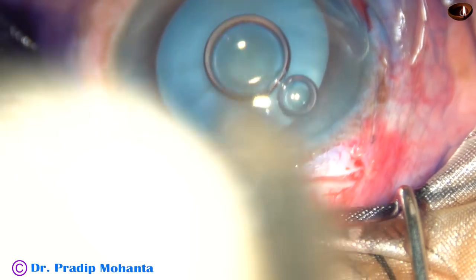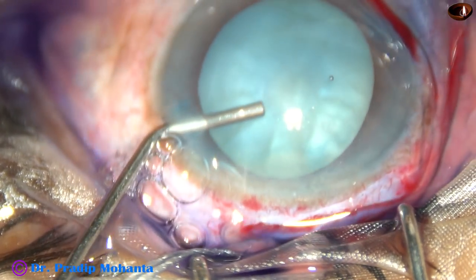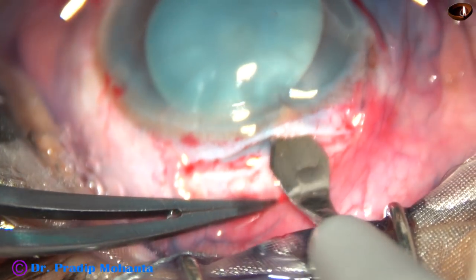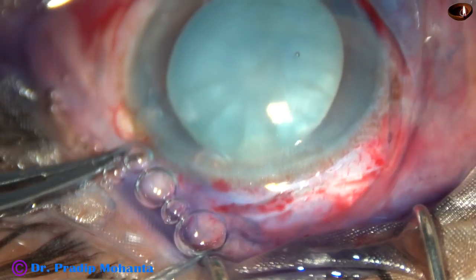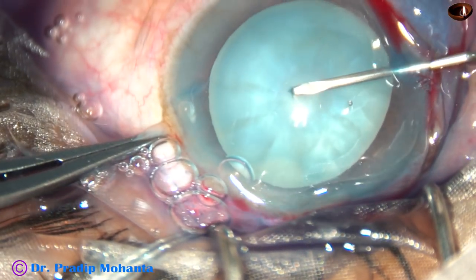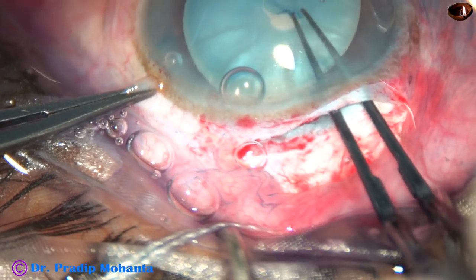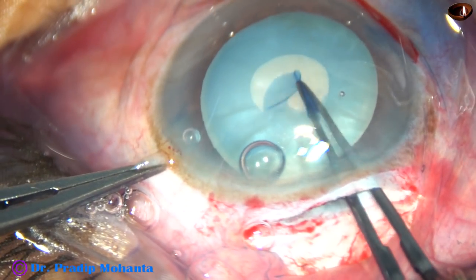After this mini rhexis is done, I enlarge the rhexis. The capsule has been stained. This is a 2.8 millimeter entry. Now through the side port I introduce a 26-gauge bent needle cystitome. Inside the capsule you can see that some oily fluid comes out, indicating high intralenticular pressure. Now this utrata forceps is used to do this small rhexis.